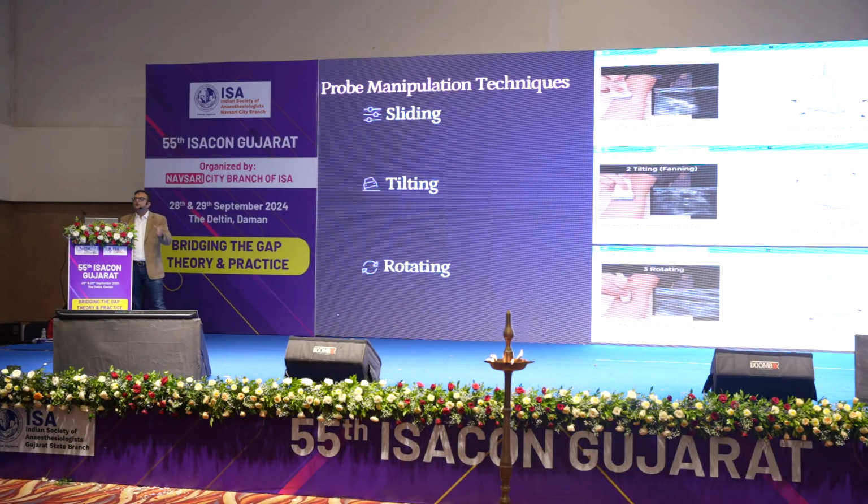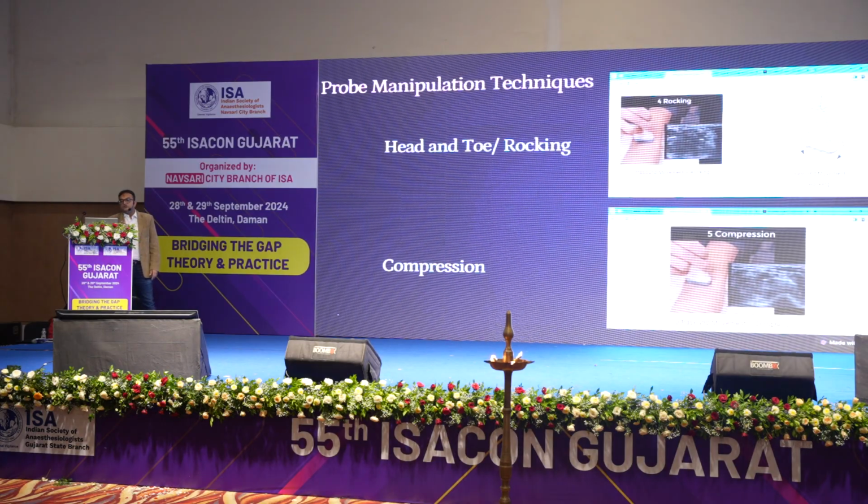One is sliding. You are just moving the probe. Here you can see. Then there is tilting. Your probe is held and you are just raising it. That is tilting. Then there is rotating. You find the desired structure in the center and to cannulate in a long axis, you are just rotating the probe. One movement is head and toe rocking.